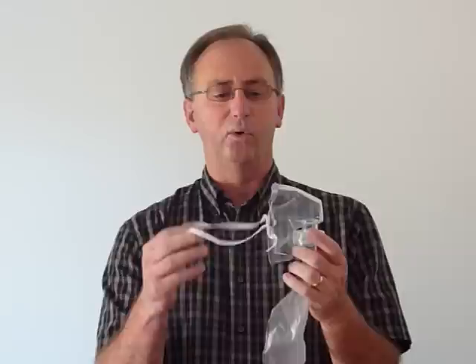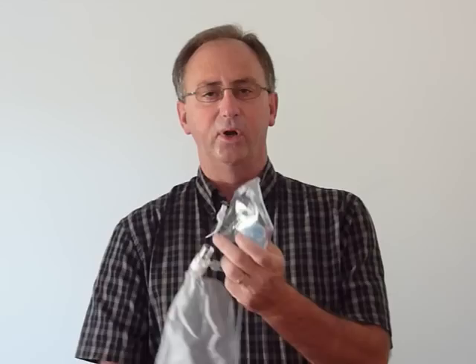You'll notice that it has the elastic headband to hold it in place. The mask is very soft and supple so that it creates a good, effective seal on the patient's face.